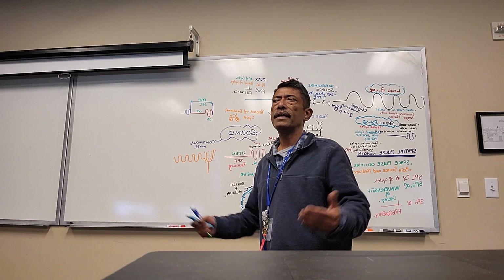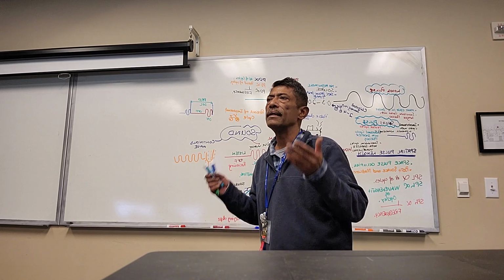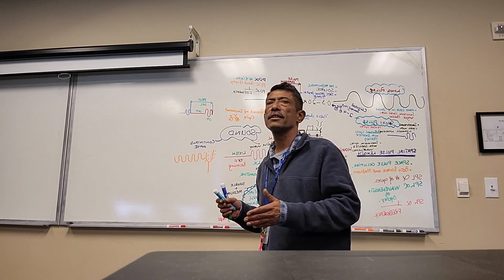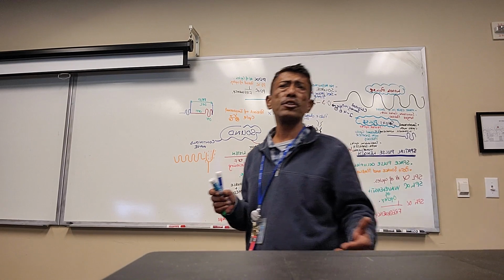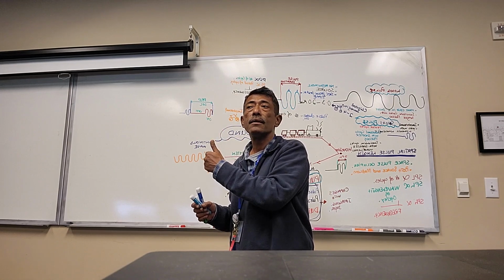Since PRP includes both the on time and the off time, and the off time is affected by the depth of imaging, there will be a lesser off time if we are scanning some structure which is superficial. There will be a longer off time if we are scanning some structure which is deep. So that's how depth of imaging affects this parameter. Does that make sense?